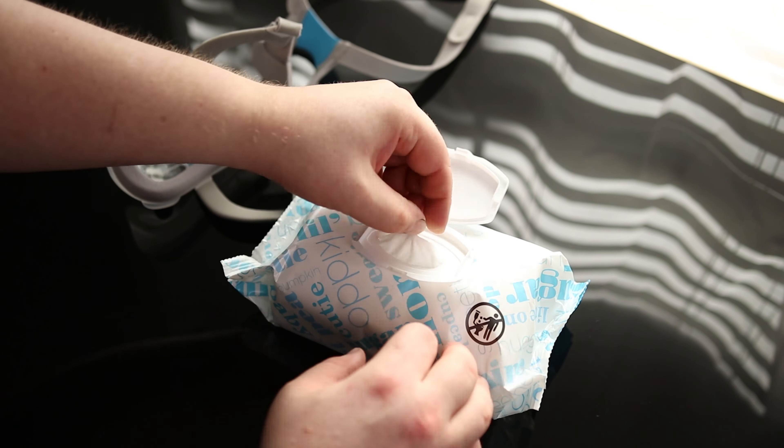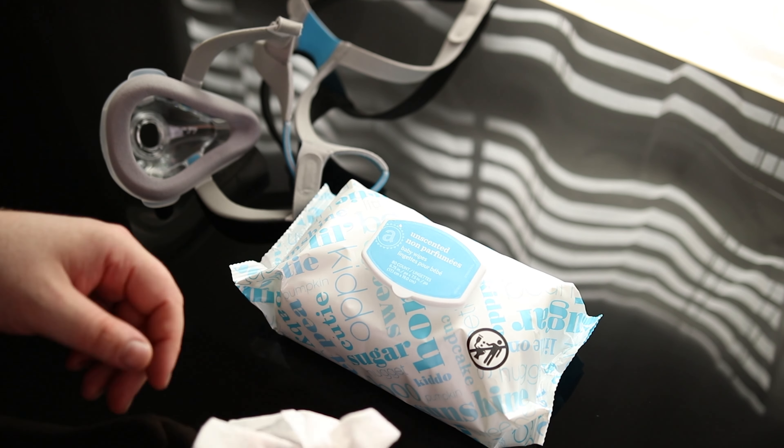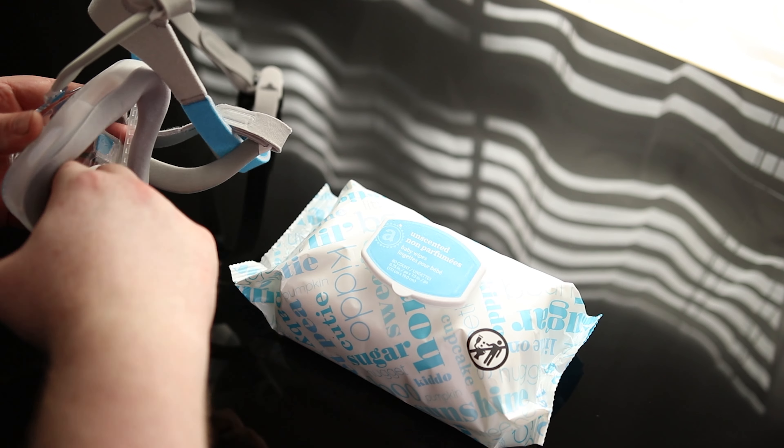Let's pull this out. It is nice that it seals back up like that, so these are always going to be moist. The idea here is we just want to clean the inside of the mask, make sure there's not developing any bacteria or anything like that.